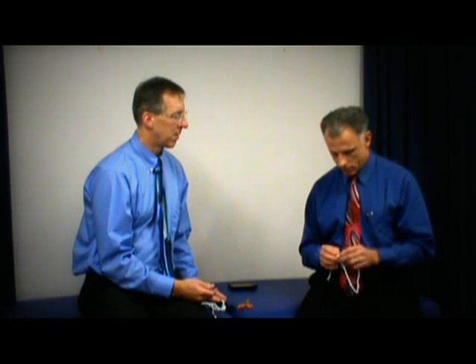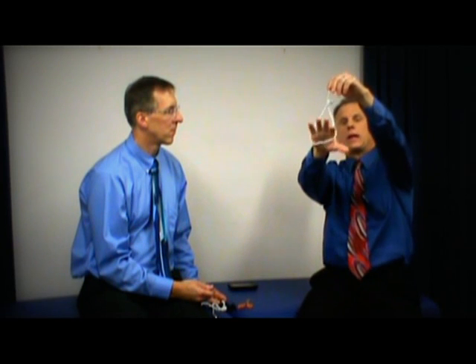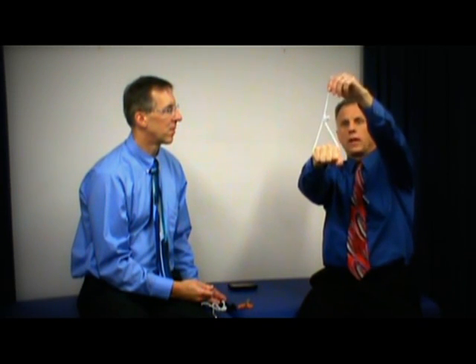I'm a half-hitch person, so I don't know if you have a favorite knot. What knot? Half hitch. Oh, half hitch. Yes. The nice thing about it is they slide, it's like tying your shoelace twice in a row. So you just make a loop, get someone handy that can make a loop. You could probably go on YouTube and find knot tying, I'm sure. And there's a handle that'll go up to the pulley, around the pulley, and then... If it's hard, you can put a washcloth in there if you don't have your PVC piping. You're not putting that much force on it anyways.